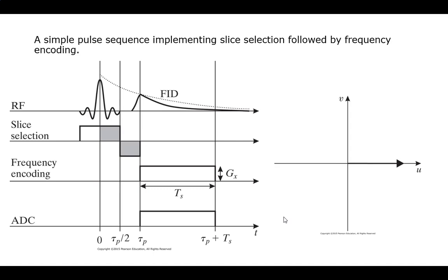That's how long it takes to encode it. I need exactly that amount of time again when I'm correcting it so I can get my signal back. That's why I just leave literally that sample time. I can add a little bit of delay time to clean it up, or do some signal to realign everybody in the way I go.